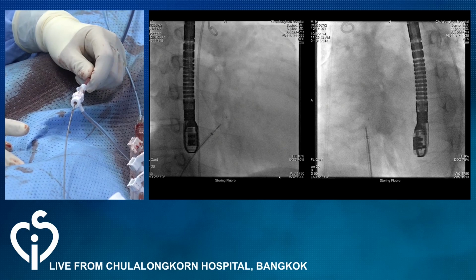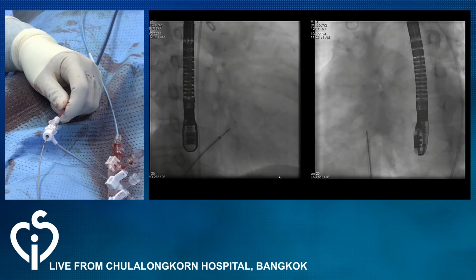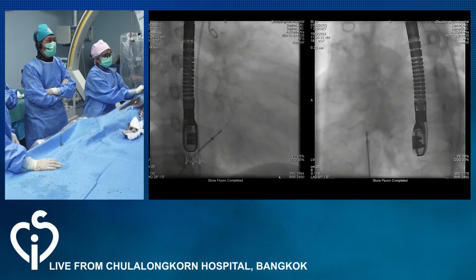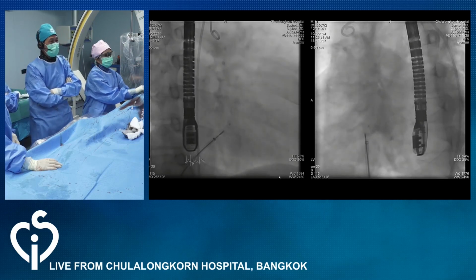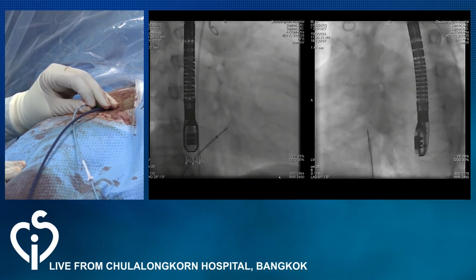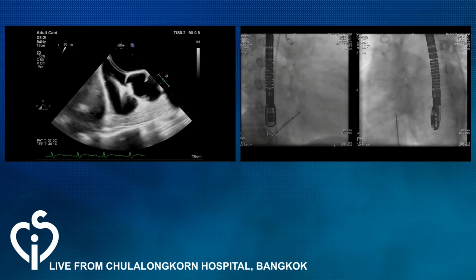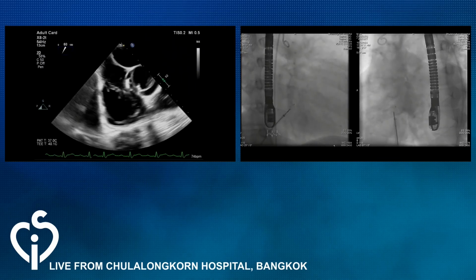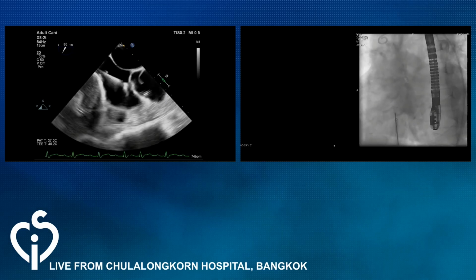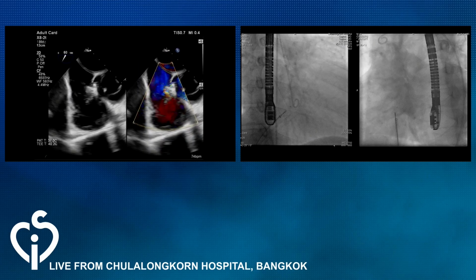Stop. One cine. And how sure are you that you're happy with this? Well, I would be looking at TOE as well. Yep. Okay. Maybe you put the TOE big. Yes. Sorry. Okay. It's here. And color on TOE? The wire looks stable in it. Yep. Yeah. Good.